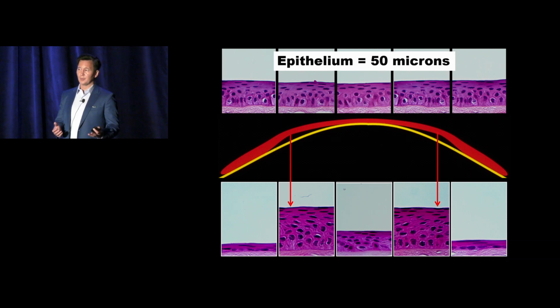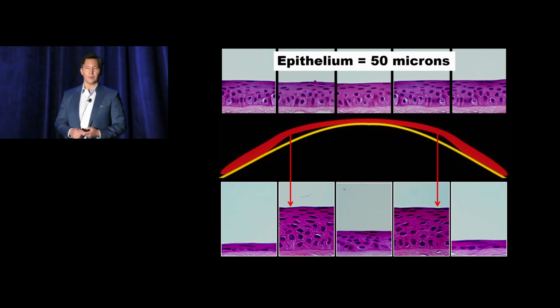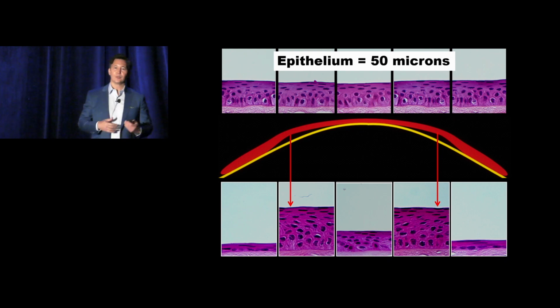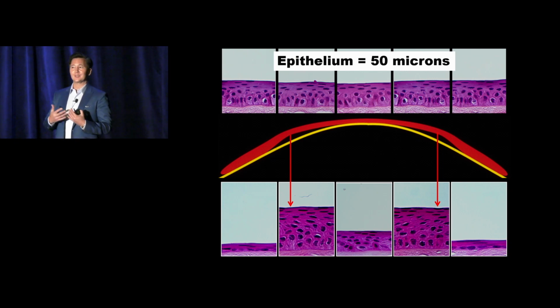Fluorescein should look acceptable. The lens should center reasonably well between blinks. The lens should be adequately comfortable. It should not appear to hit the central cornea. If it hits the central cornea, usually it goes lateral. So we're looking at those things, but ultimately what we want to know is, can we dispense this lens?